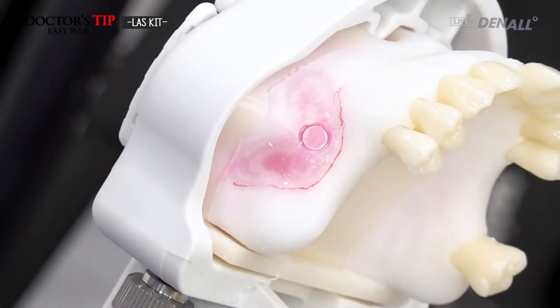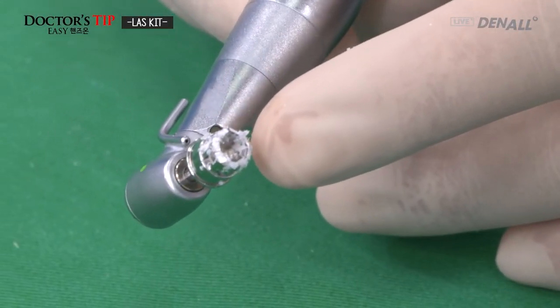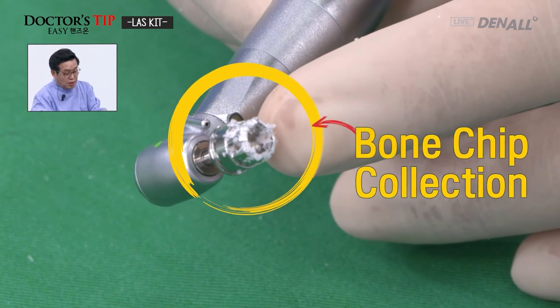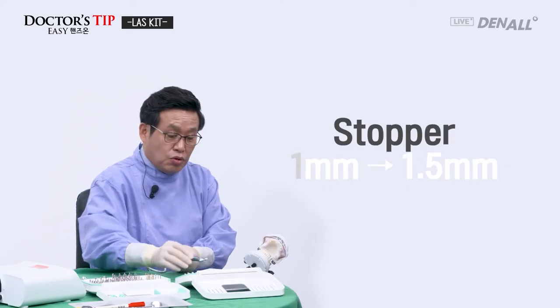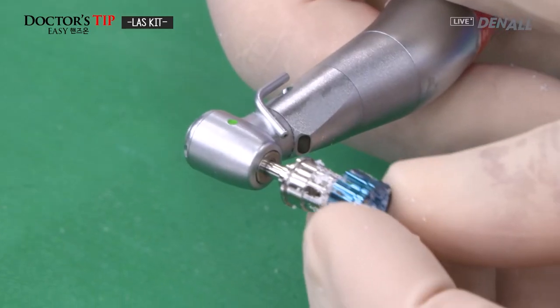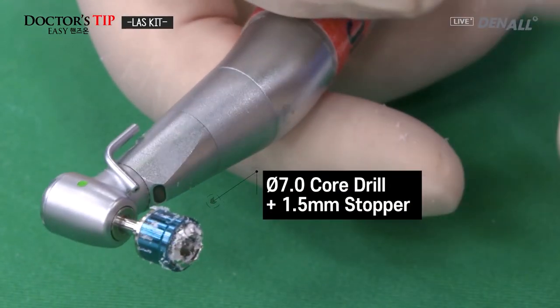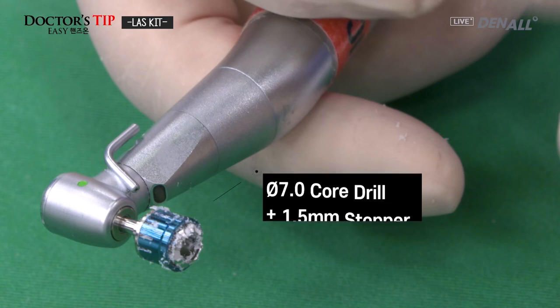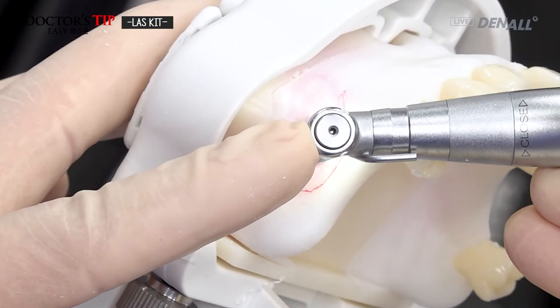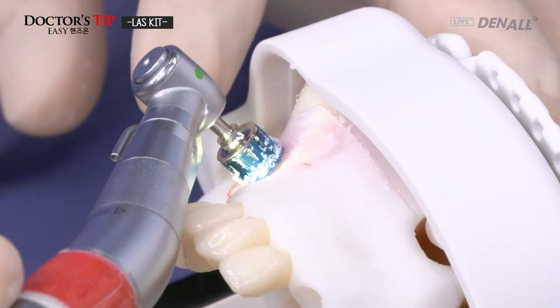Like this, if you drill, then as you can see, if you remove the stopper and core drill, you see the bone chips have been collected. The window is not fully formed, so I'll go one up again, 1.5. The 1.5 stopper is mounted to the core drill. Like this, we form the window.